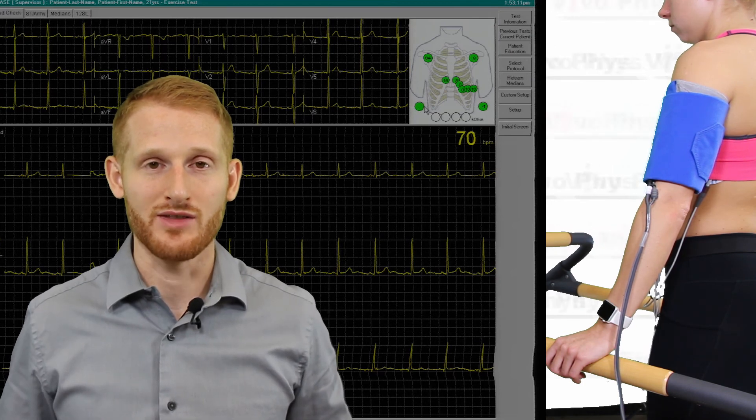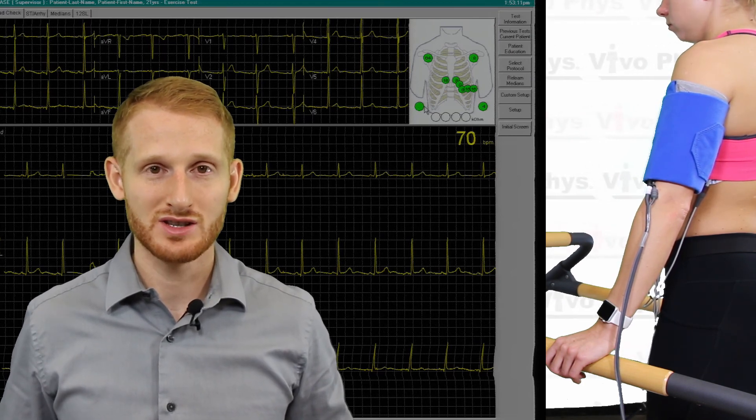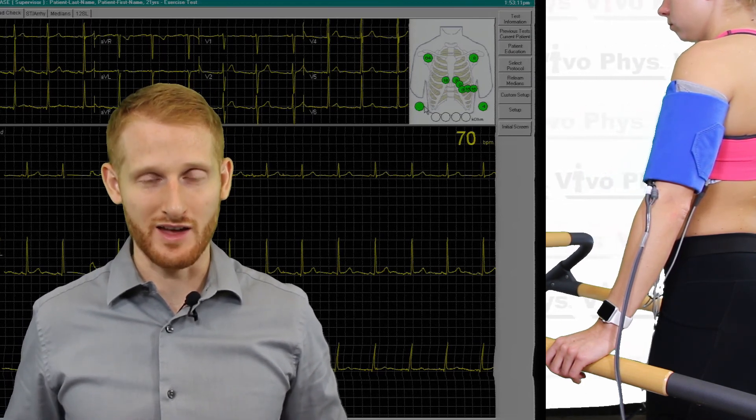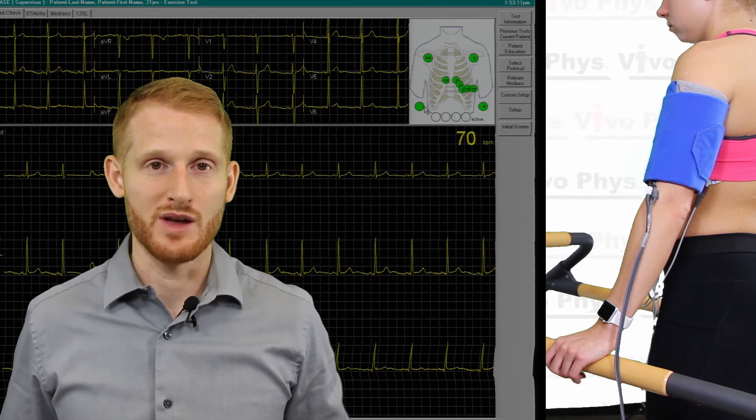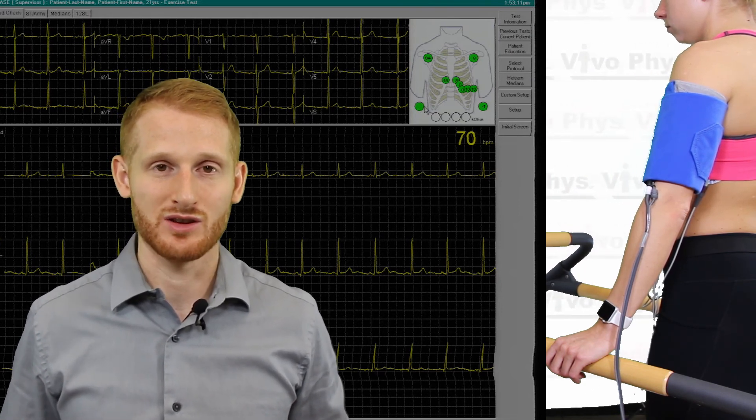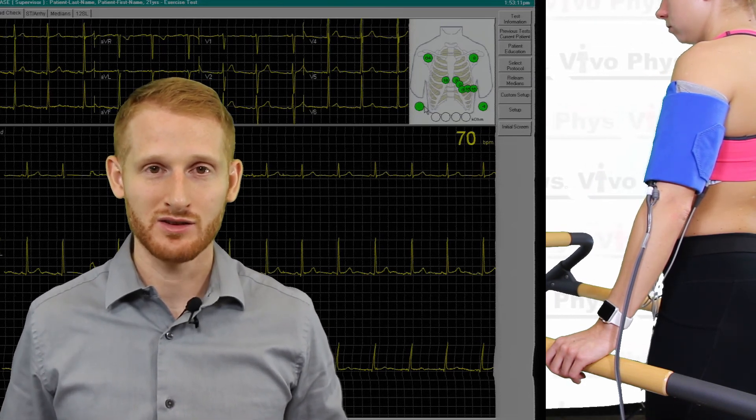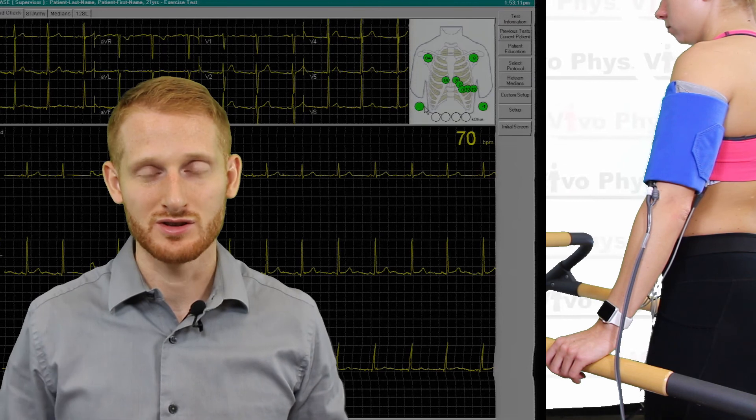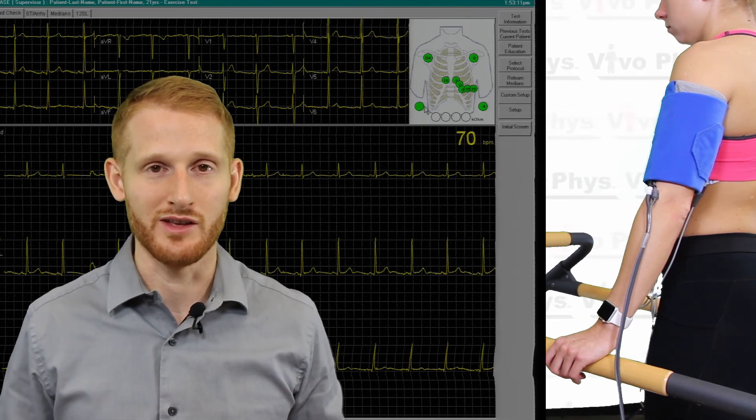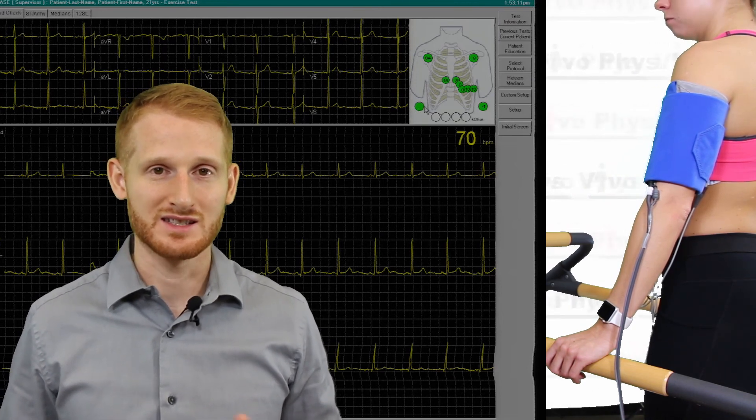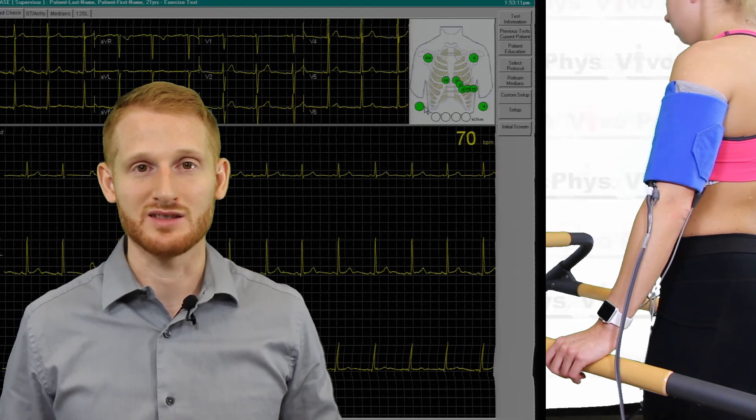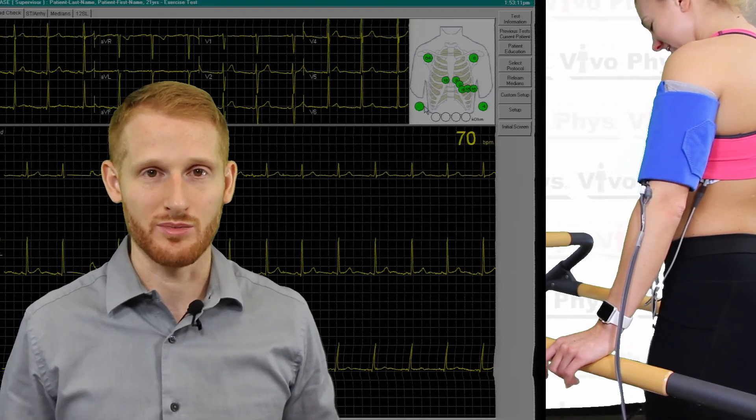Look at that diagram. Make sure all the electrodes are green. If they're not green, that means there's poor connection, and this is only going to get worse with exercise. Make sure that they're green at least at the beginning so that they can hopefully be a solid electrode for the entire test. If they're not green, try putting a little pressure. Make sure there's a good seal of the adhesive on the skin. If it's still not going green, I would replace the electrode and reprep that site.